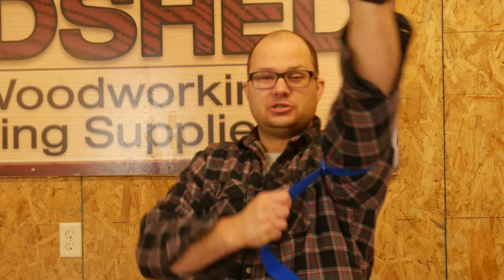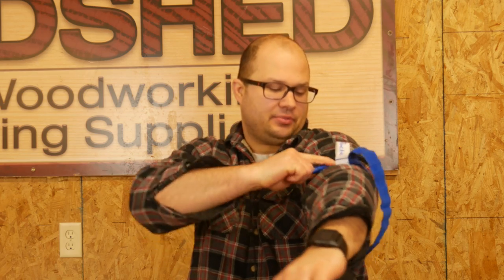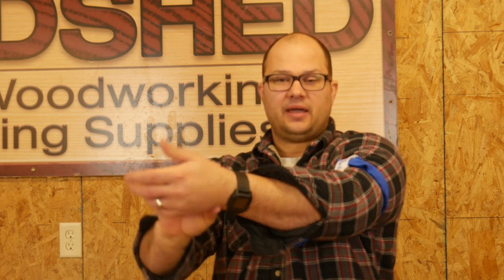You're going to pull that sucker as tight as you humanly can. Wrap that around so that's pretty tight there. Then you're going to use your little windlass and you're going to take out all of the slack that's left in that tourniquet. You're going to go until it's painful right there — that hurts. Stuff that windlass in there, wrap the rest of the strap over the top. I take the rest of this thing, come over the top like that. I'll then check my pulse to make sure that I have no pulse in my arm. I have no pulse, so the blood flow is obviously cut off. From there, you can obviously remove the tourniquet and regain feeling in your arm.